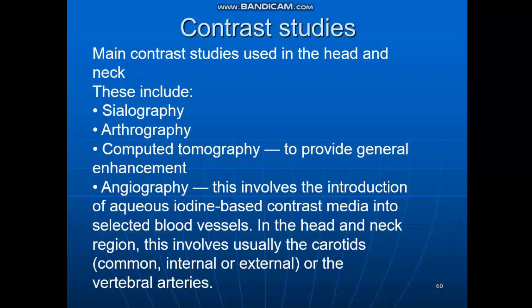Contrast studies. This investigation uses contrast media, radio-opaque substances that have been developed to alter artificially the density of different parts of the patient. Thus, by altering the patient, certain organs, structures, and tissues invisible using conventional means can be seen.